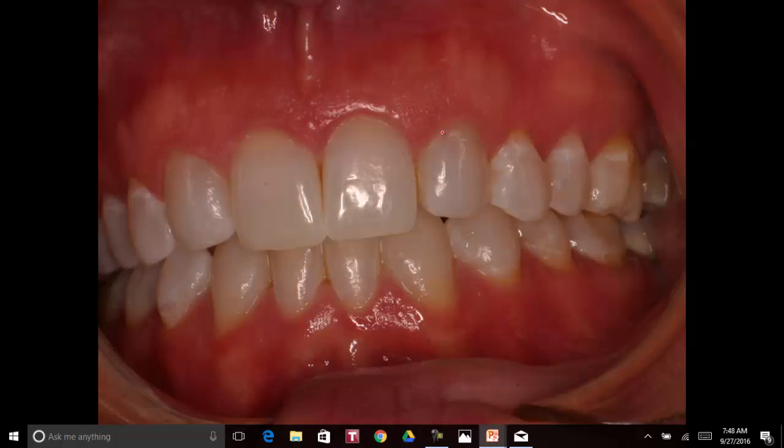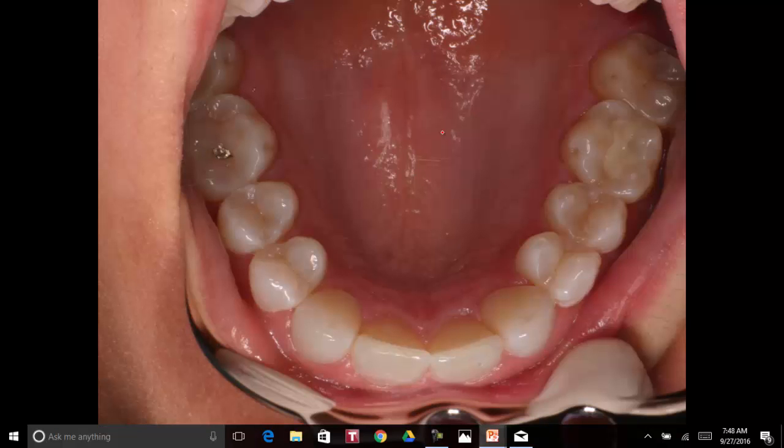She's got beautiful center teeth, and I was just so proud of her when she came in. Now I'm going to add a little bit on the way we shape these things. This is the upper looking down on the upper. You have to kind of trim out a little on the lingual. Because the upper teeth have to miss the lower — if you left this thick here, this would hit the lateral on the bottom and stop. So you want it to go past. You've got some overjet and overbite, so the teeth up here won't interfere. You have to trim them a little bit on the lingual side. Then we took a little off the mesial, a little off the distal, some off the tip, then trim the lingual. And then trim a little bit of the labial and polish it up. And they just look like laterals.